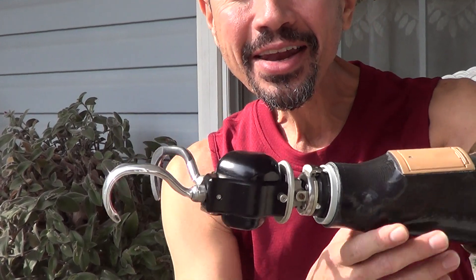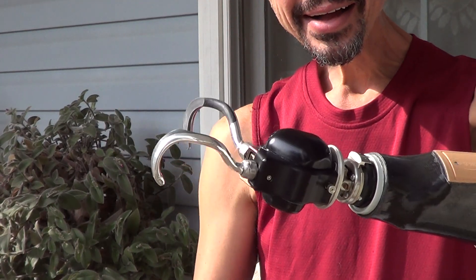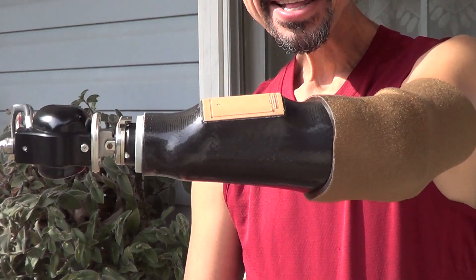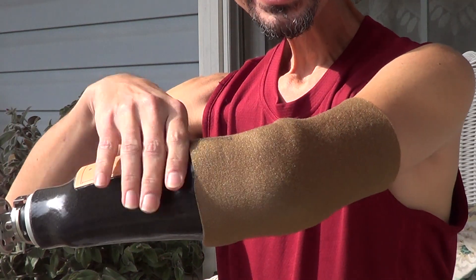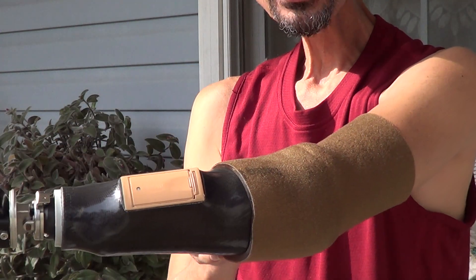Hey everybody! I wanted to show my new prosthesis. I've got it on now and it's fitting better. This is it, and Hanger gave me a sleeve that helps keep it on better.